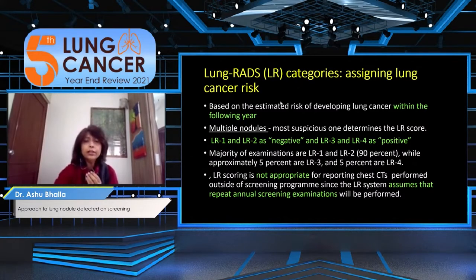So if we look at these categories, this estimated risk of developing cancer is only in the following year. That is why the Lung-RADS categories cannot be applied to incidentally detected nodules, because this categorization assumes that the patient is going to return to you in a year and you are going to repeat the scan. You only need to specify if you need to do something differently. But in a real life setting, when there are incidentally detected nodules, the patient is not going to return to you in 1 year. So that's why the guidelines and the recommendations will differ. LR1 and 2 go under the negative category, and 3 and 4 go under the positive category.